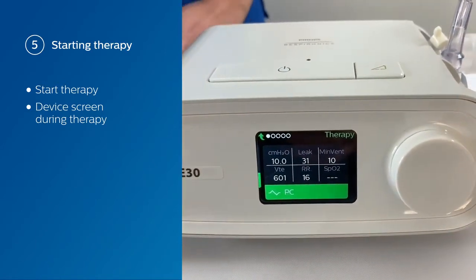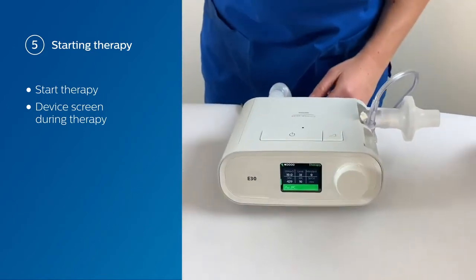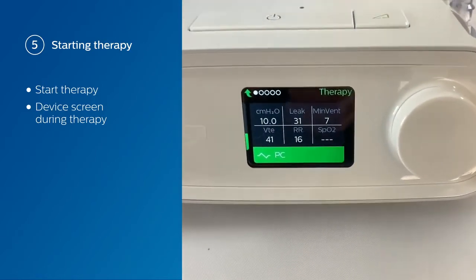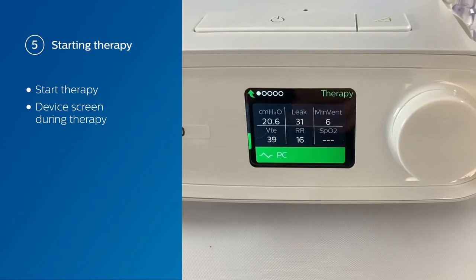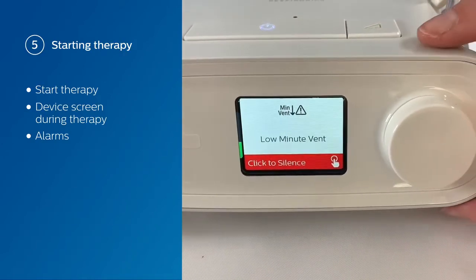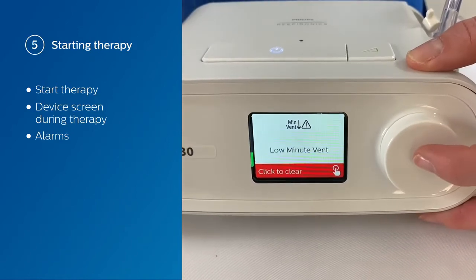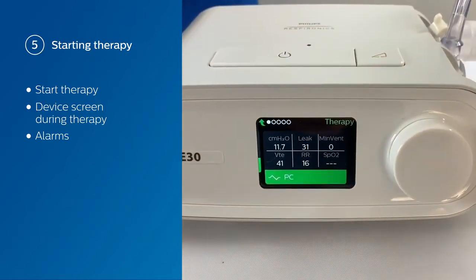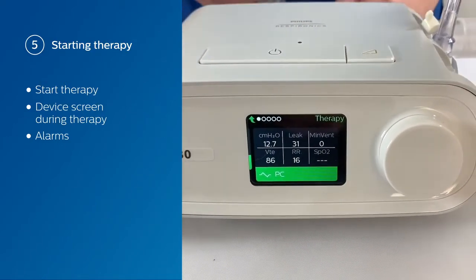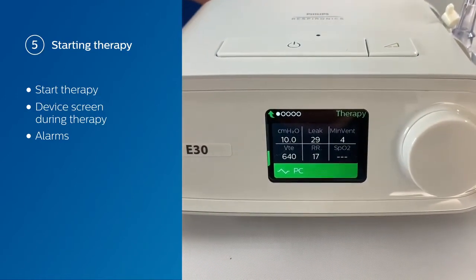What we're going to do is pretend our patient's lung condition changed. You're going to notice our min vent is actually dropping. Since we set our low min vent alarm to 5, once you reach 5, you're going to see the low min vent alarm go off. We have to click to silence that, and click again to clear. Then we're going to change our patient's lung conditions back to where they were, and you're going to see our min vent slowly increase and get back to where we were before.